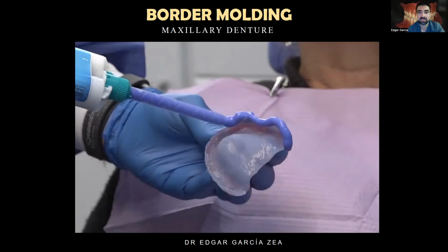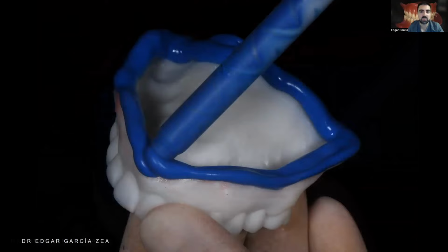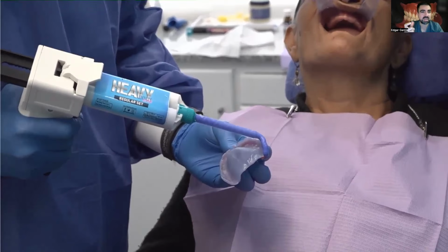I like doing the border molding with heavy body normal set. Okay, the one with the syringe. I'm not talking about putty material; I'm talking about the heavy body material. And in the upper denture, it's not going to change from what we are used to doing. I think it's the same. The one thing that I do not do is put any spacer with wax. I do it directly on my model.